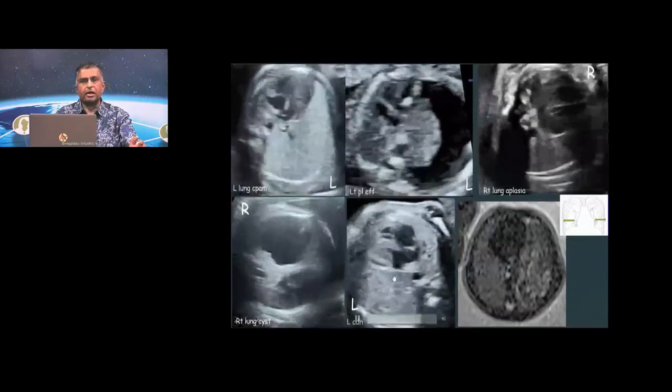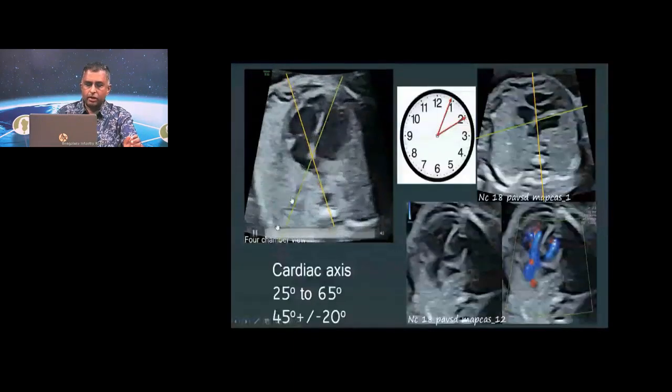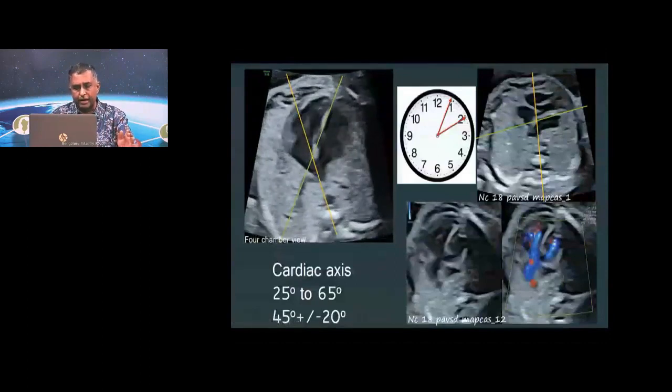These are all very evident, but in less evident cases, you need to be very, very critical in your observation. Critical in the sense that if you draw a midline median from the spine to the sternum, in the normal situation, that's the line I'm talking about. This is the line. Sorry, this is the sternum. If you look at the heart in relation to this line, you'll find 2/3 of the heart to the left and only 1/3 of the heart to the right of the line. And that is one thing we should bear in mind.